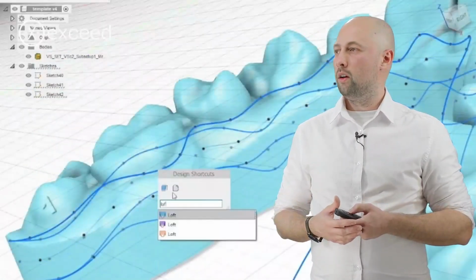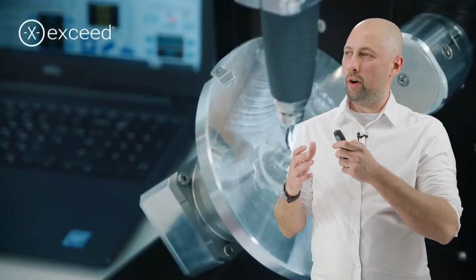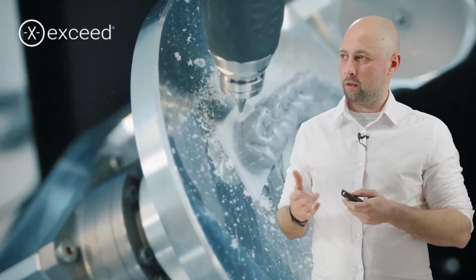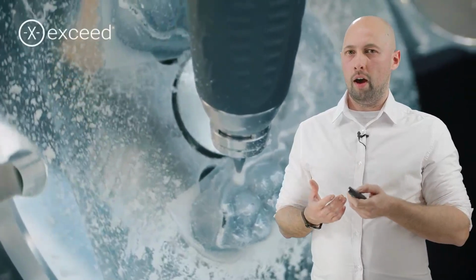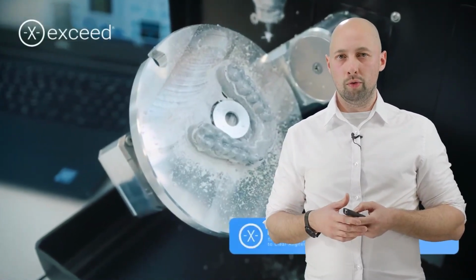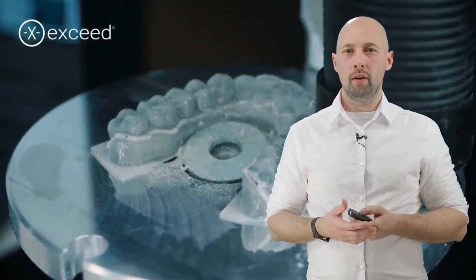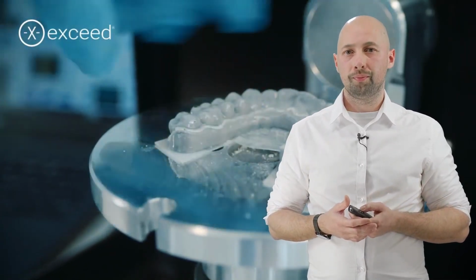And then the next step is to put in the milling coordinates, so the hardware can understand when and where it actually needs to make a cut. So you can see that it's being cut. And then at the end, you will have the automatically trimmed aligner. So automatic trimming can be a great way to increase efficiency, reduce costs, and eliminate the need for manual trimming, and make a high quality, precision cutting line.